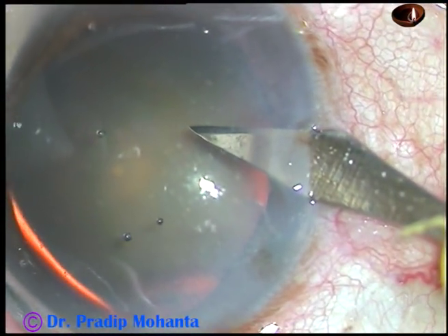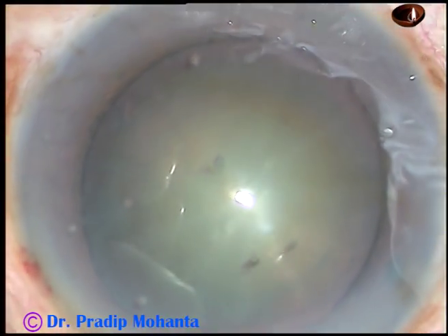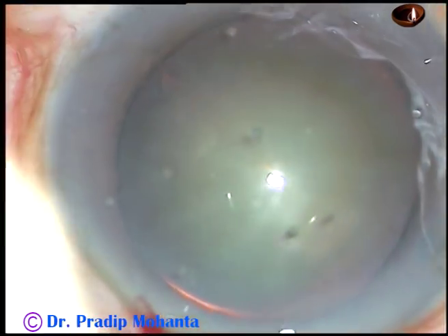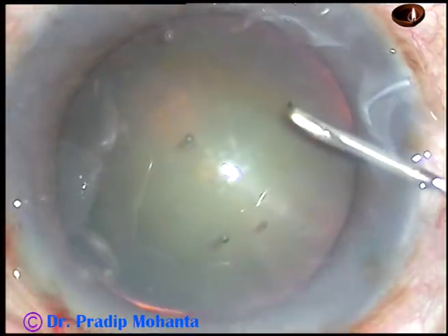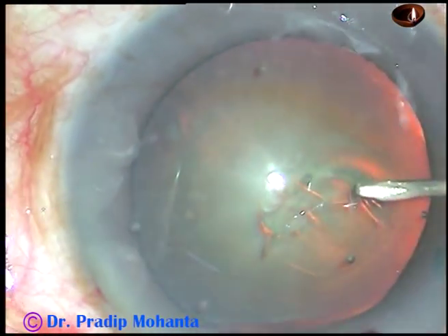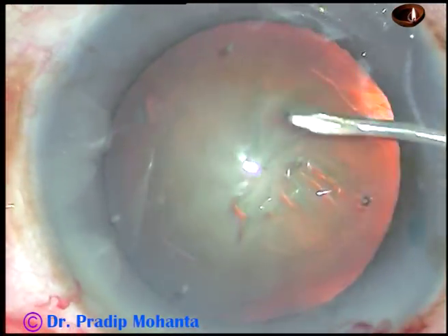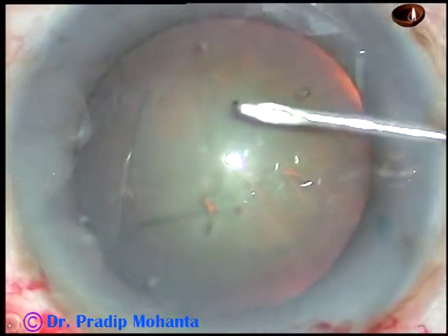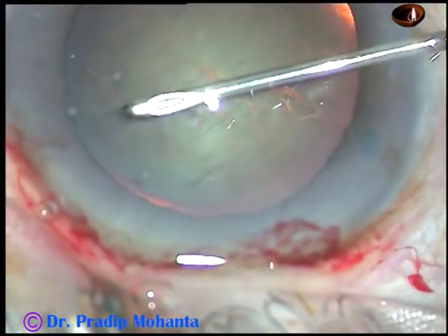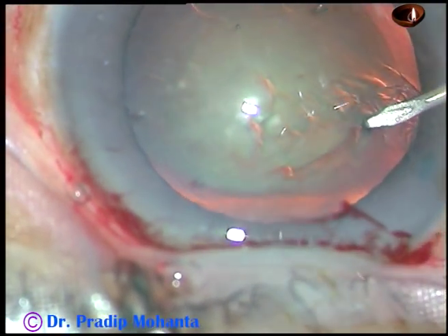This is another side port. So 2 side ports have been made on either side of the main incision. And now, capsulorhexis. In this case, I found the anterior chamber very shallow, so I decided to do the rhexis with the needle itself. The 26-gauge bent needle cystitome creates a flap. The flap is flipped and guided all around, and an adequate-sized capsulorhexis is performed by the needle itself.